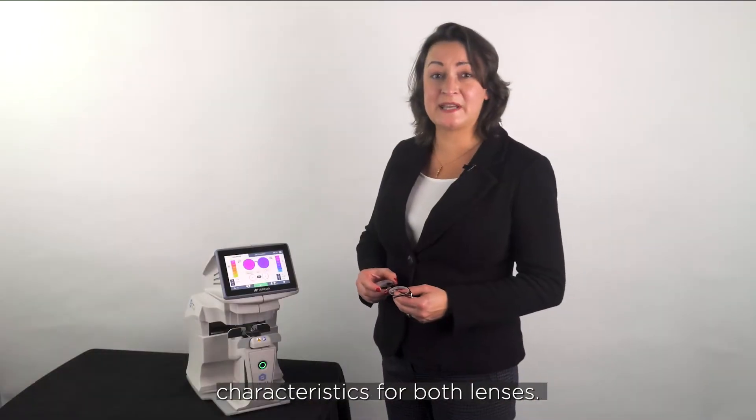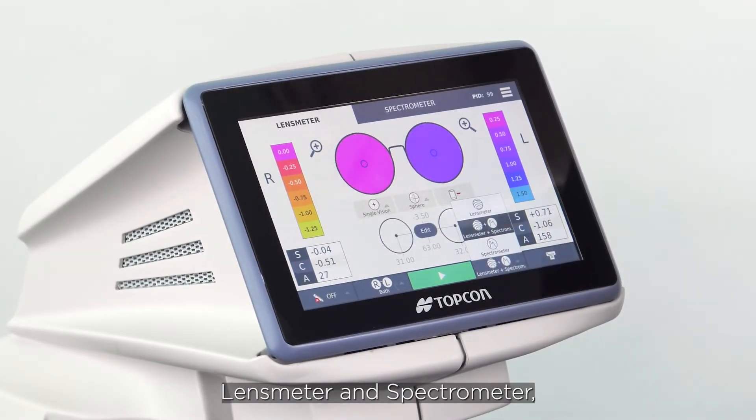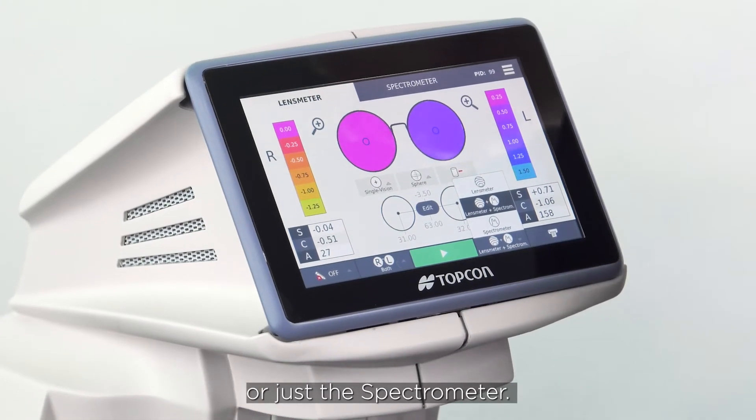I want to measure all of the lens characteristics for both lenses, so I'm going to select lens meter and spectrometer, but you can just select the lens meter on its own or just the spectrometer.